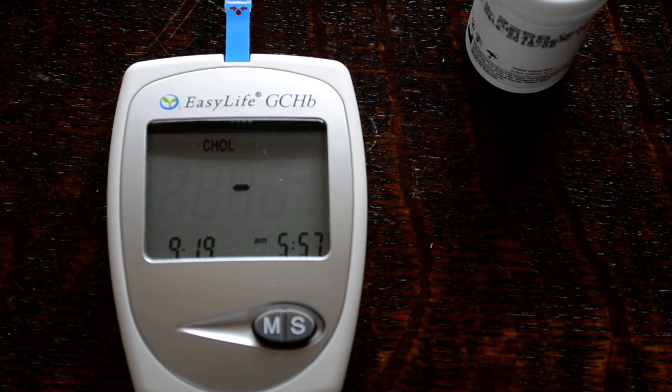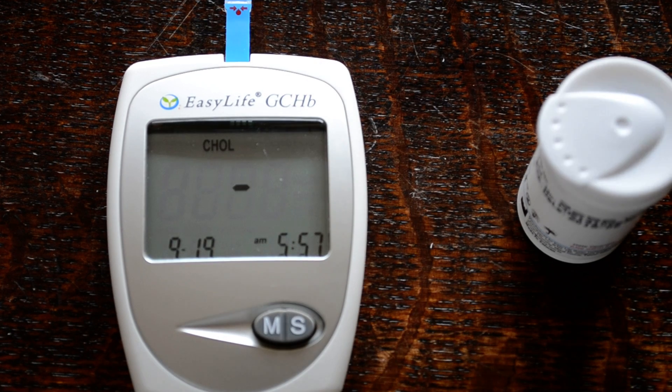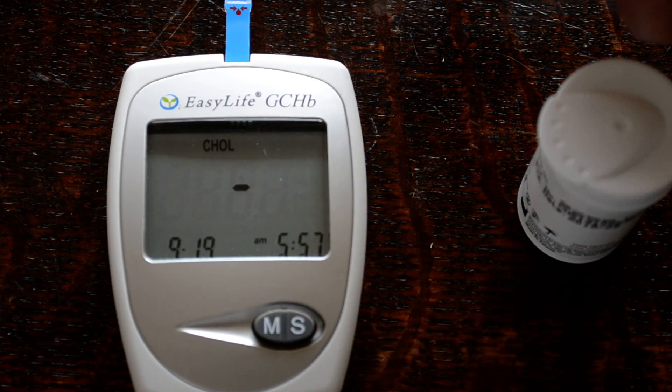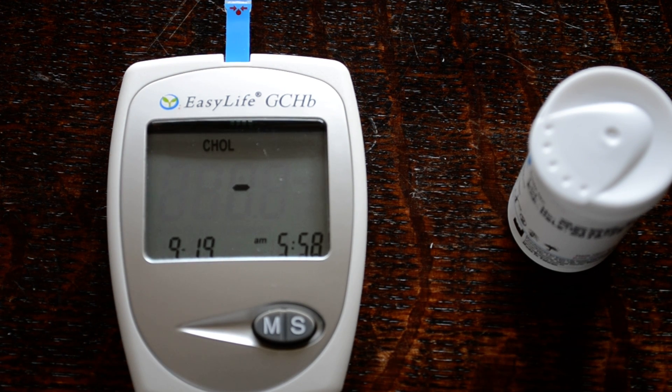Now we're ready to do a cholesterol check. It's asking you to apply blood on the side of the test strip. The blood sample volume has to be 15 microlitres — a very small amount — but you do have to use an auto-lancing device, which is supplied with the meter, and lancets which do the finger prick. Once you've got the finger prick of blood, you apply it to the side of the strip, it's drawn in, and the meter gives you a cholesterol reading.